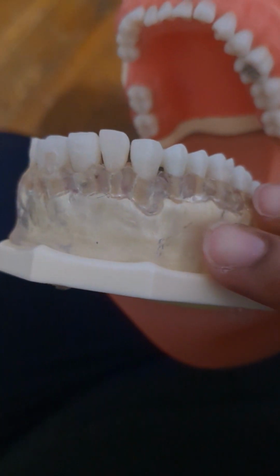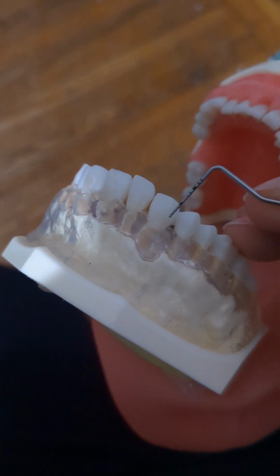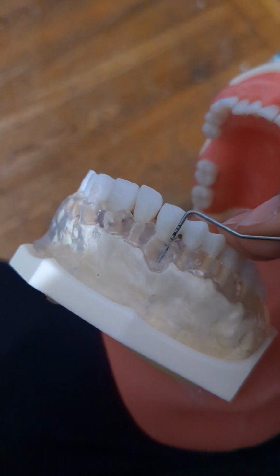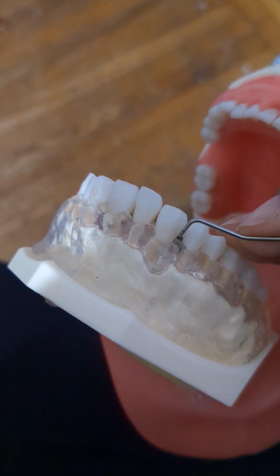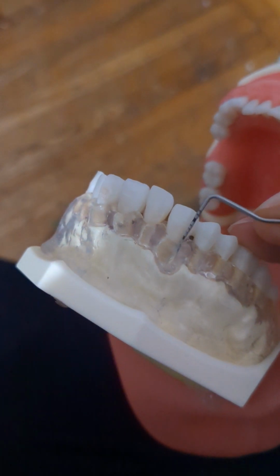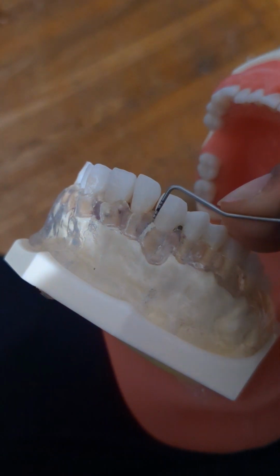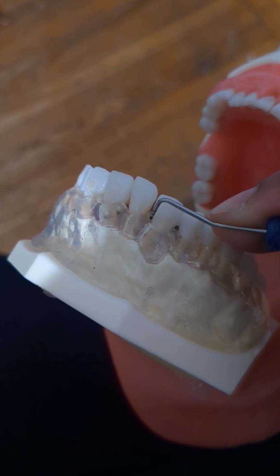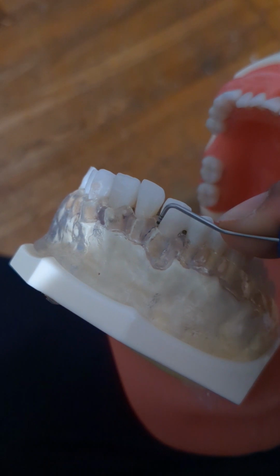Okay, now we've changed the position of the teeth. Okay, so we're going to start with the canine. We're going to go distal line angle, insert, walk, rotate a little. So for this one, we have a 9, walk it back. Okay, it looks like we had a bit of a 7, and now it's going to be a 9.